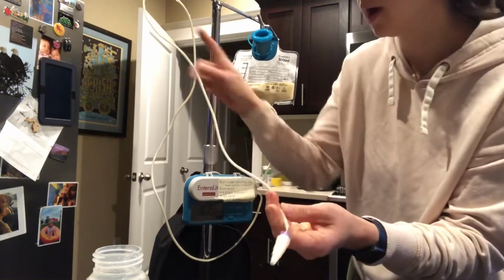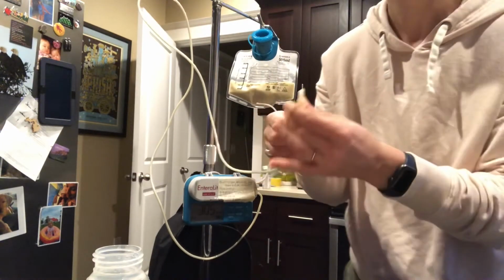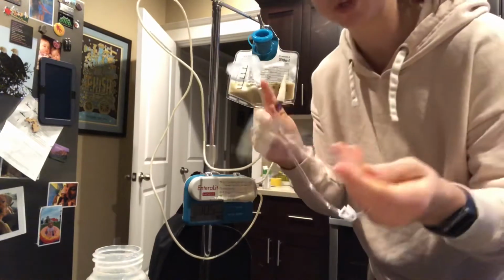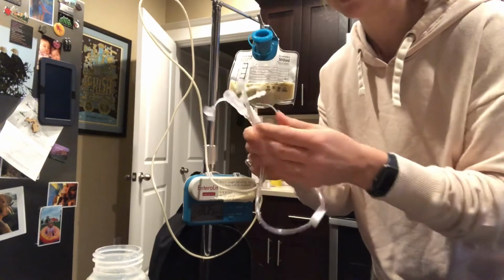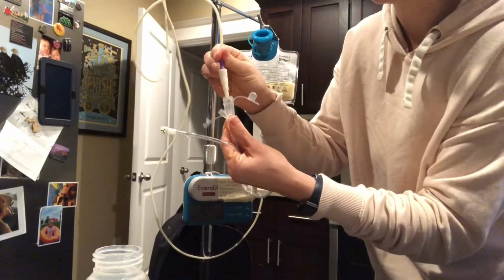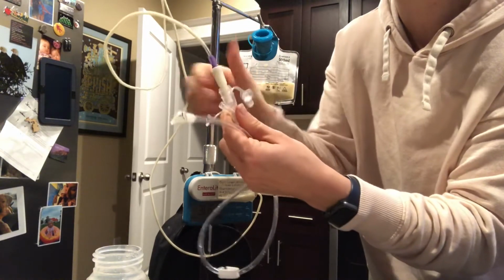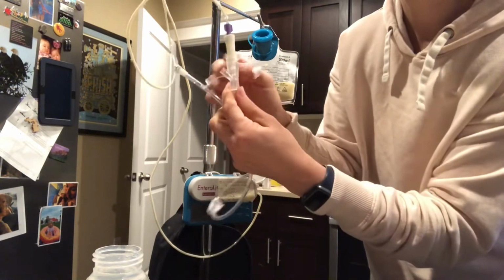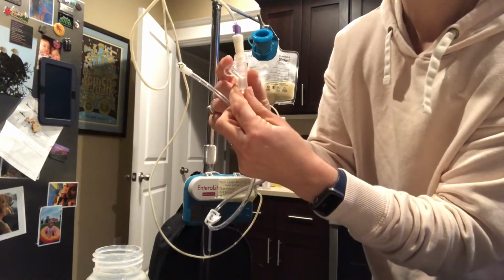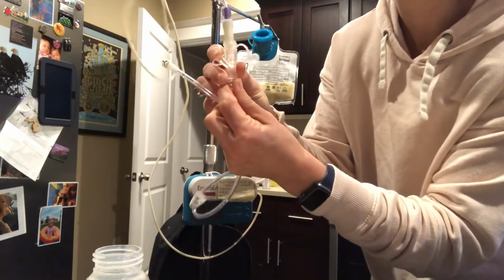So now the formula is through most of the feeding tube, almost to the end. And what I have to do now is actually prime the extension that hooks up to her tube. So this bigger end hooks up to the tube. All you do is you just stick it in there. Push it firmly, but don't push it too far because it'll tend to just pop out with any pressure. There are two holes, a big one for this and then a smaller one. Make sure that the other hole is closed, otherwise all the formula will just come out of this small tube. So just make sure that it's closed.